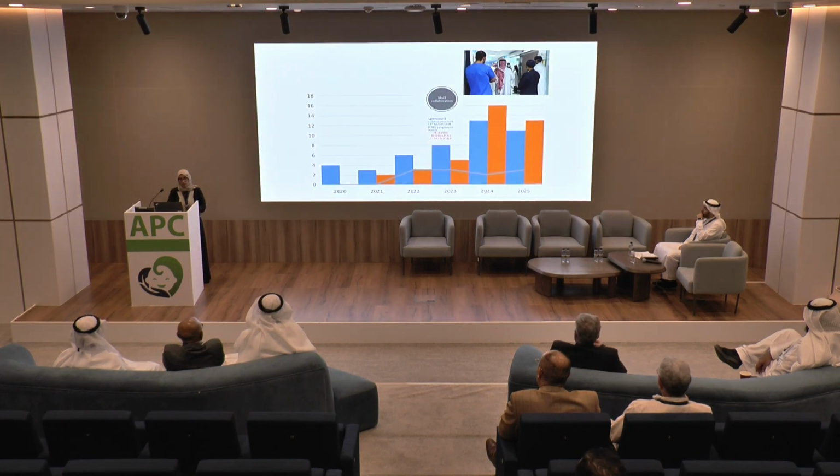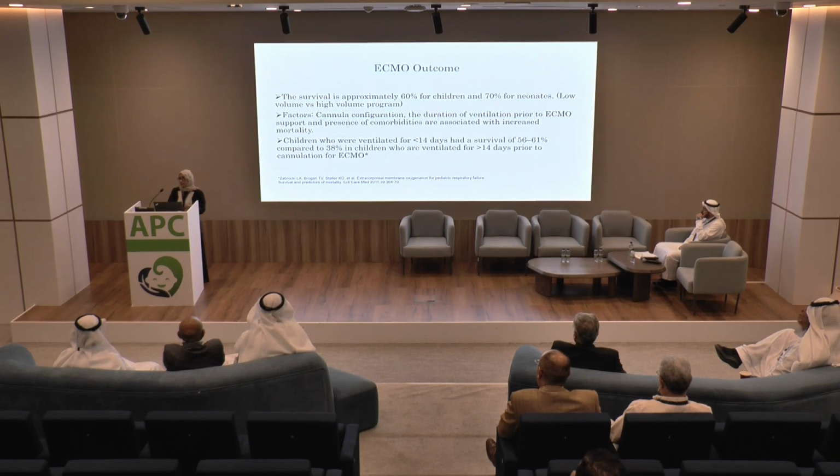Since we are part of the Ministry of Health as a transport center, we've been increasing the criteria. VV ECMO is used most of the time, but some patients need cardiac support as well due to cardiac failure, going into VA ECMO. The survival, fortunately, is comparable to the international and maybe beyond, because we're being very selective. We started from a bigger age group until we developed the team and expanded.